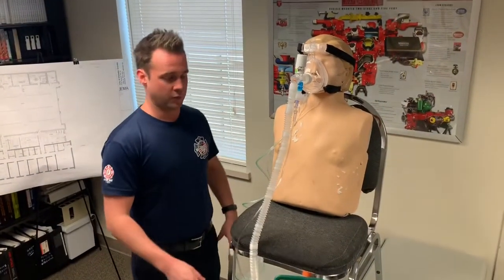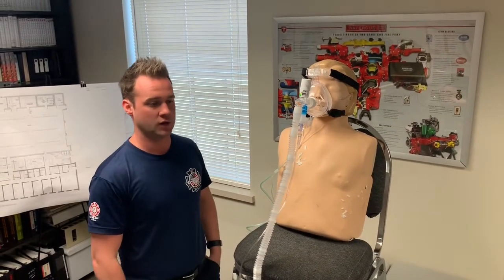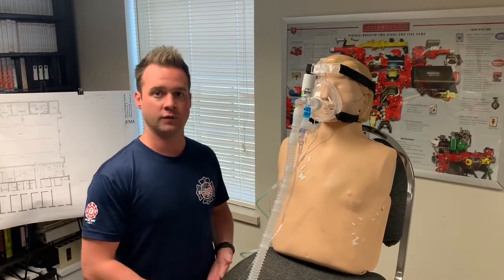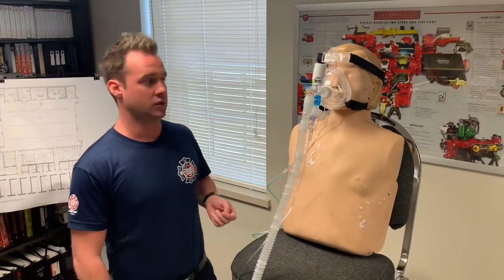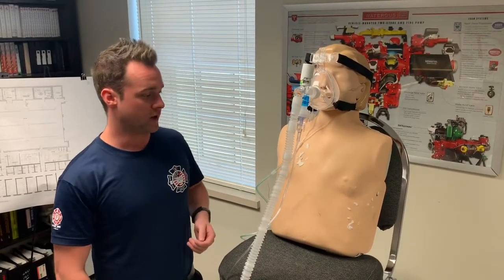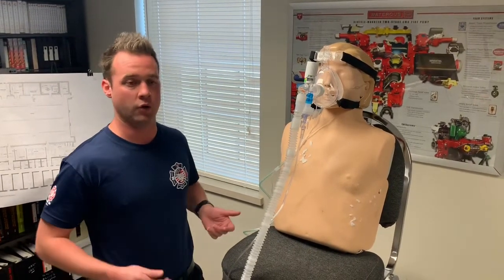So when we have the patient on CPAP, the improvements that we're going to be looking for are obviously SpO2 of 94% to 99%, as well as hopefully bringing their end tidal CO2 in range, which we like to see between 35 and 45 millimeters of mercury. We'll be assessing lung sounds. Most of these patients that need CPAP are going to have diminished lung sounds. So if we can hear a little bit more clarity, that's great, as well as a little bit more volume.